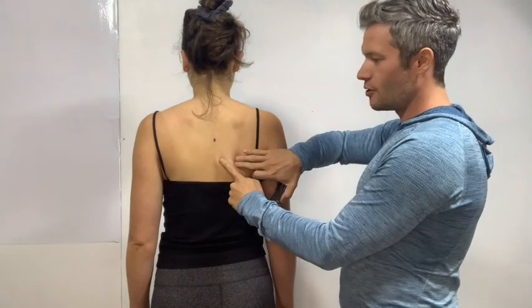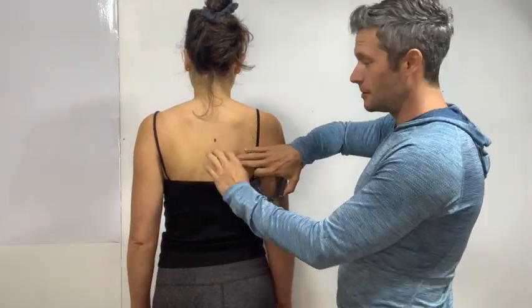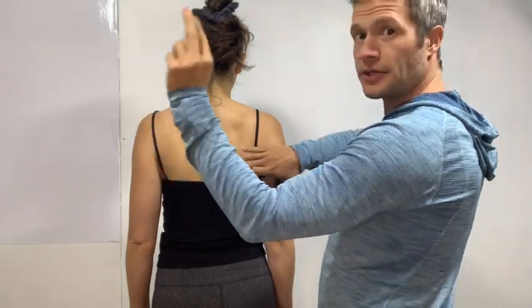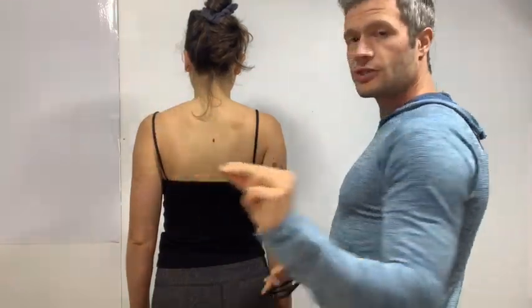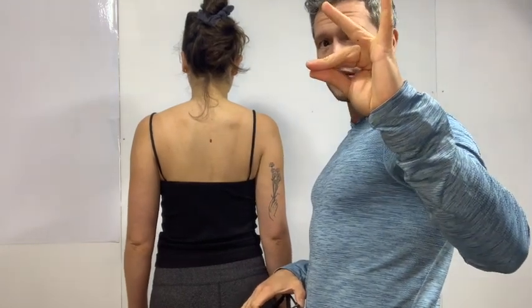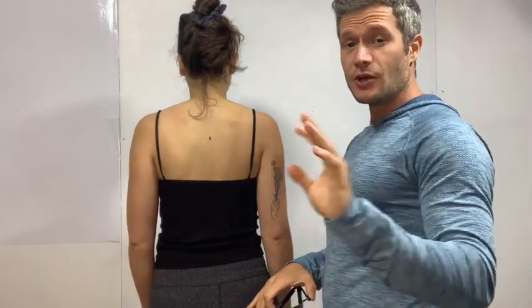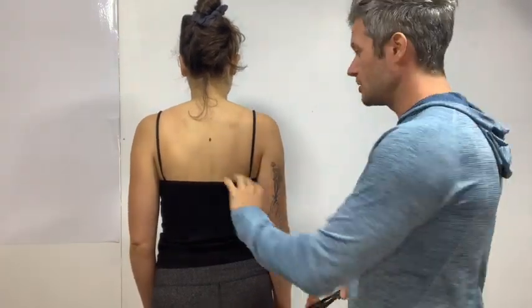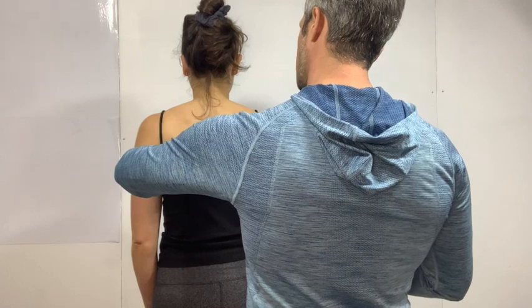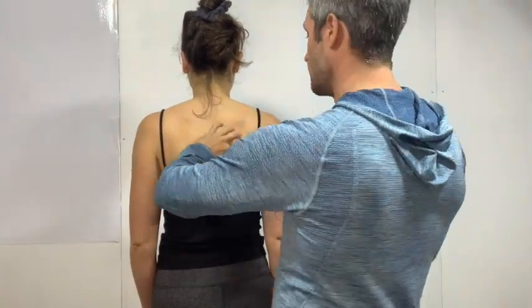From there, I'm just going to go work down and find a nice angle right along the border of the scapula. I'm going to take a fairly broad hold. So there's two schools of thought. There's C and V. So you notice the V is fairly closed. The C can be quite sharp if you have fingernails. So I typically go with the V pinch. Little bit of an angle, and essentially just pull the skin out away from the body, okay?